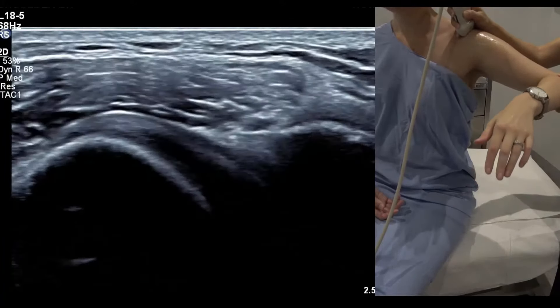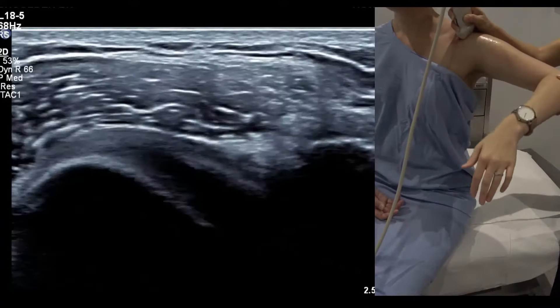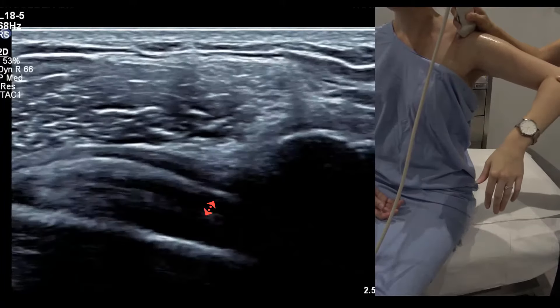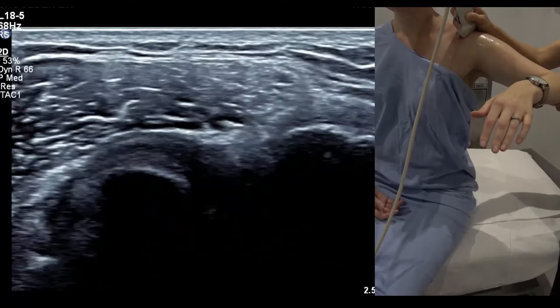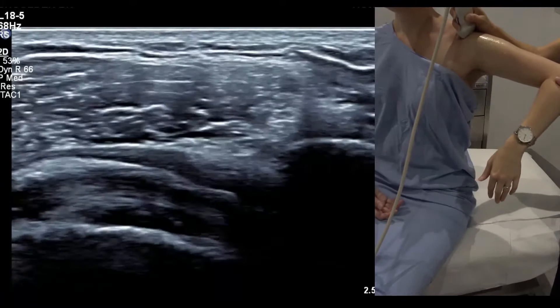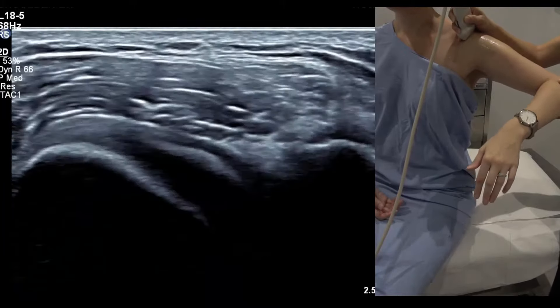This position is what really makes the bursa bunch — if it's going to click and bunch, it'll do it here. Watch it a few times; it naturally thickens up, but if it's not bunching and not reproducing symptoms, that's a normal asymptomatic finding. That's scarecrow to stop sign. This is something adhesive capsulitis patients can't do — they'll only make it to about this height, rotating to about there with pain of five to seven out of ten.